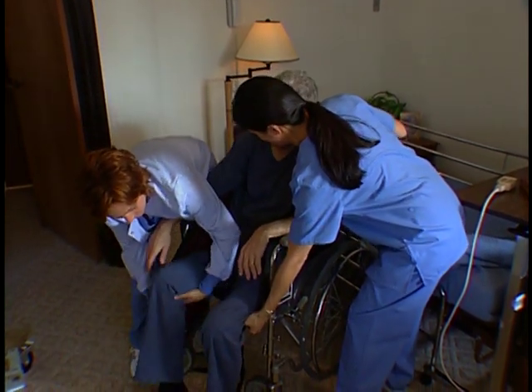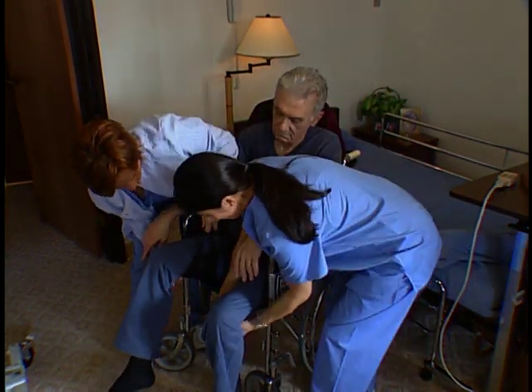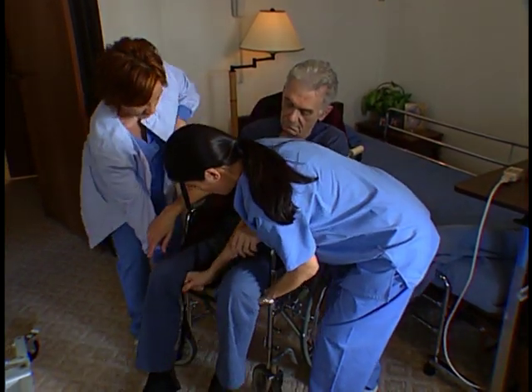Keeping the sling from twisting, work the leg of the sling along the crevice between the patient's legs and the side of the chair. Get as much material going toward the front of the chair as possible.